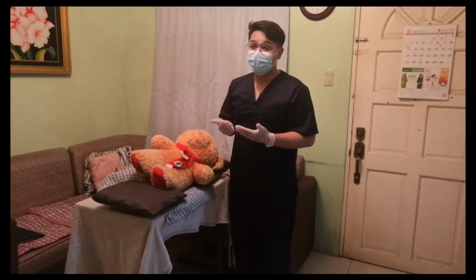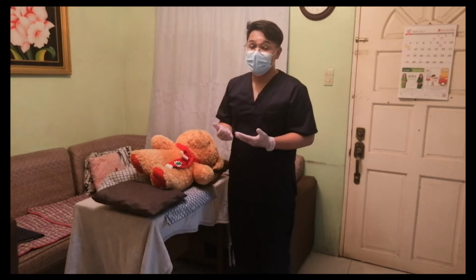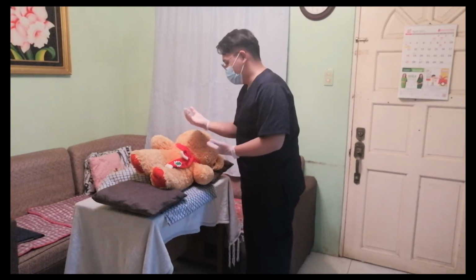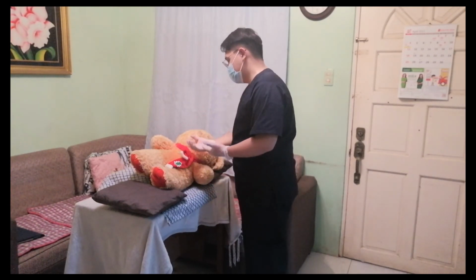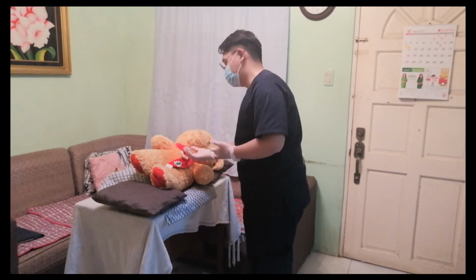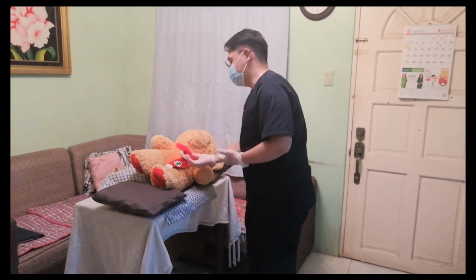which is we will need to lower the bed to the lowest position with the rails up. And after that, we will need to make sure that the call bell and other necessary items are within easy reach. So for example, I have the call bell in my hand. Okay. Ma'am, ito po yung call bell. Kung may kailangan po kayo, alam niyo na po ang gagawin niyo. You just need to press this button para po ma-alert po kami. Okay po?